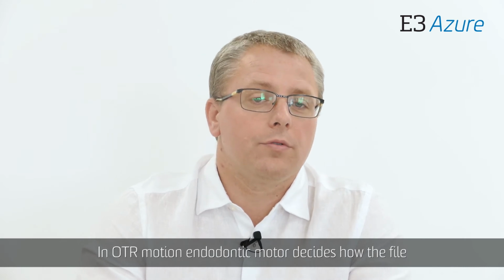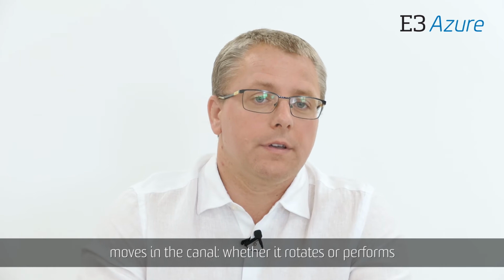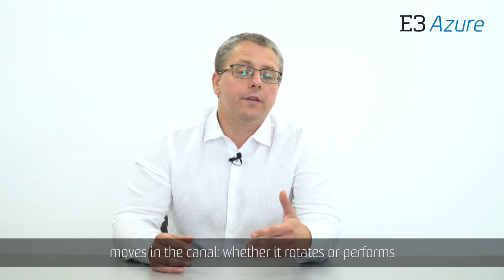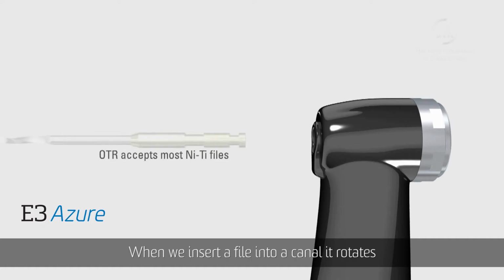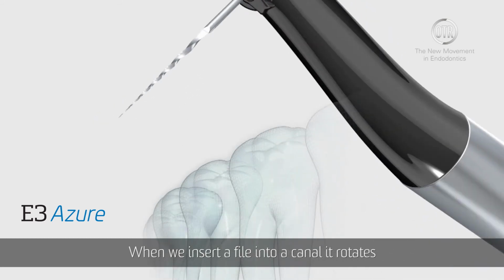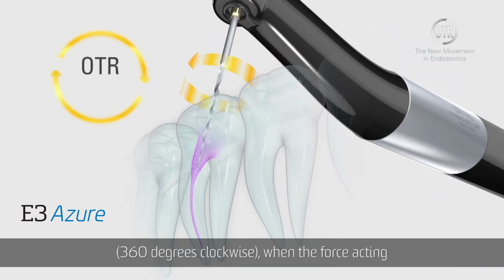In OTR motion, the motor decides how the file moves inside the canal, whether it rotates or performs reciprocation motion. When we insert a file into a canal, it rotates 360 degrees clockwise.